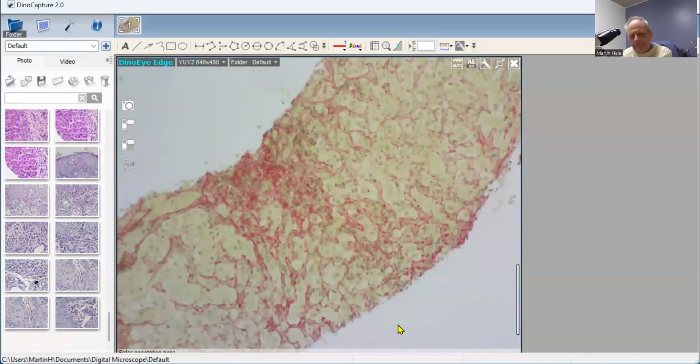Thanks, Bilal. So it looks then as though this indeed, in fact, is showing 2 pathologies. The first is autoimmune hepatitis, and the second is chronic ethanol use. What is interesting about this is that we don't have any steatosis. And that, I think, could probably be explained by the fact that he's being investigated now for about 6 weeks, I think it is, isn't it, Bilal? So the fat could have gone.